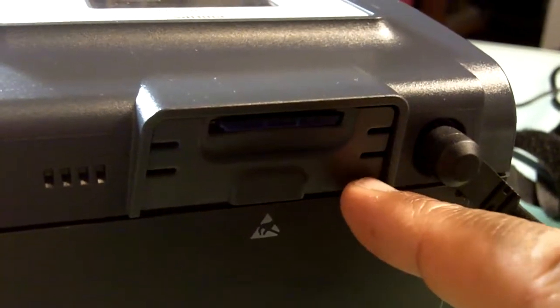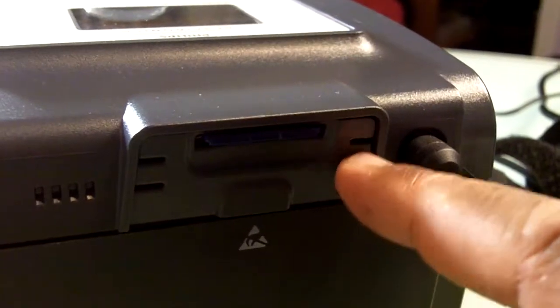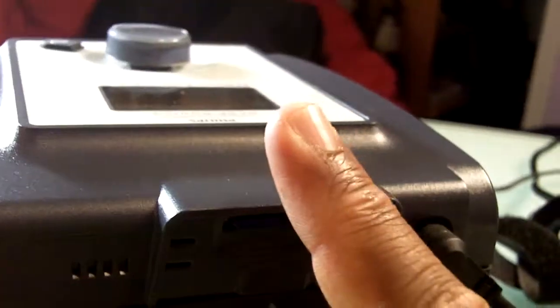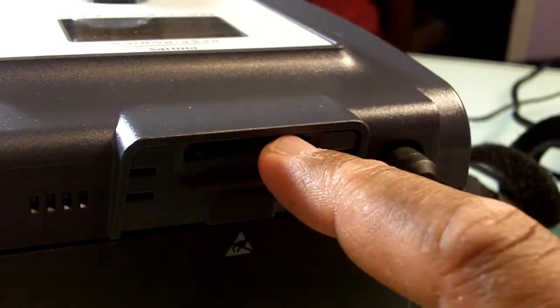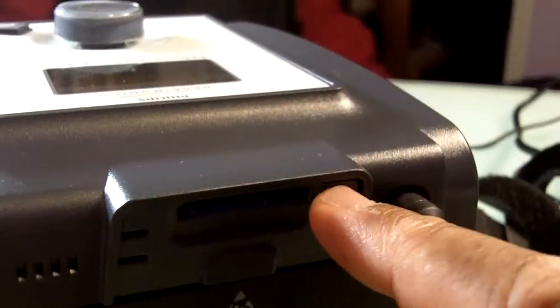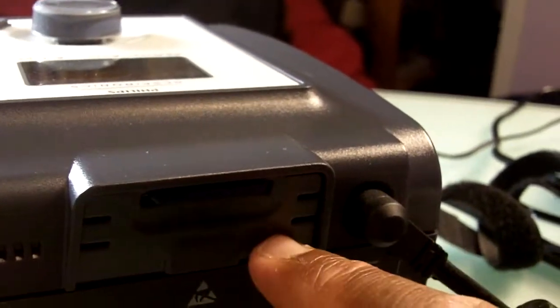We can also attach, depending on your home medical equipment company, they can actually attach a wireless modem with an antenna sticking out. And that can transmit data to the software that reads this thing. A lot of major sleep centers and major teaching hospitals have this software, so they can attach it right in here.